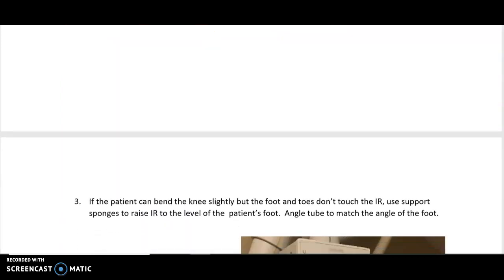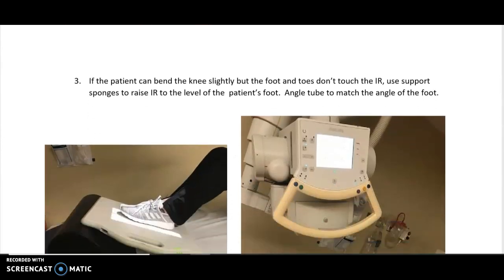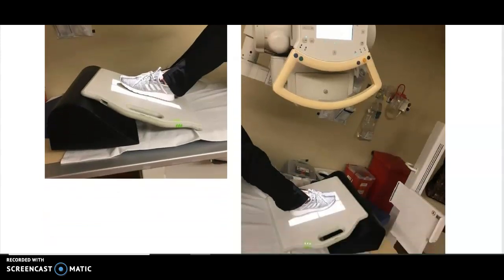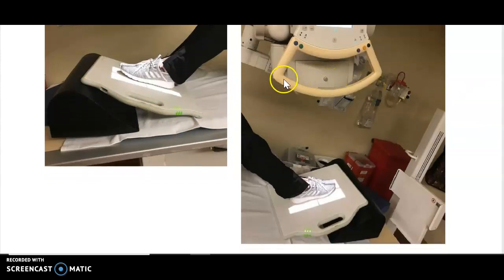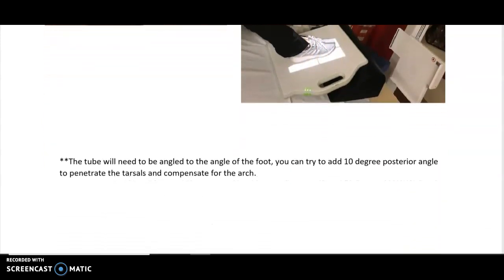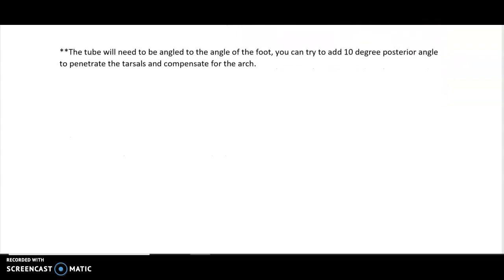If they can bend their knee but the foot is at a more severe angle, use a larger sponge — like the black larger sponge — to support it. Because it's at a steep angle, angle your tube to the foot. You can try to add your standard 10-degree angle to help penetrate the tarsals, but most of the time in these situations you just angle to the foot and take it as is.